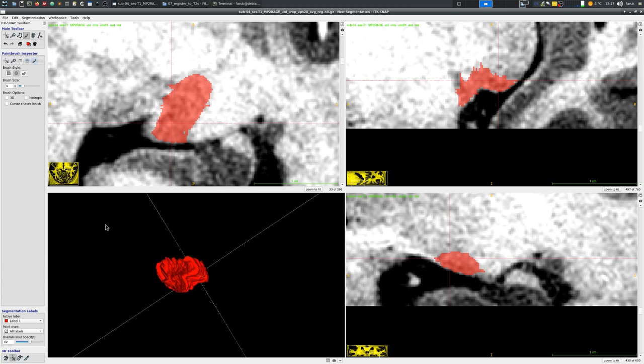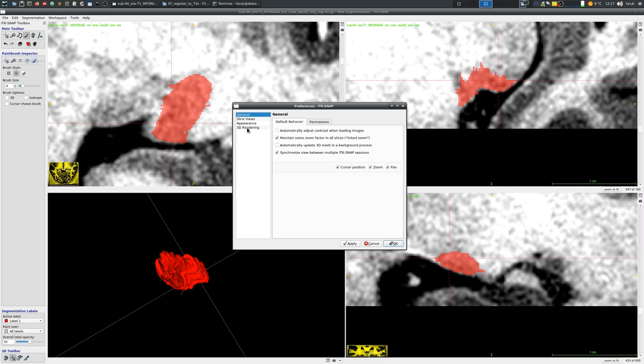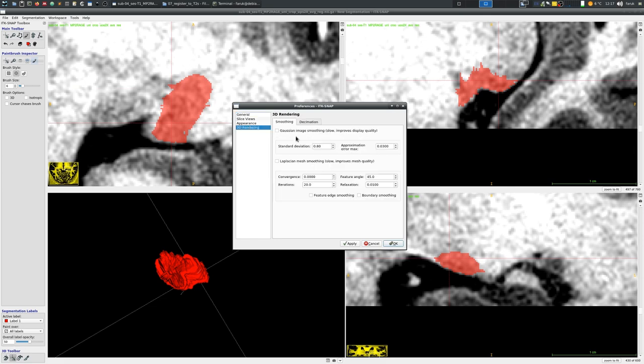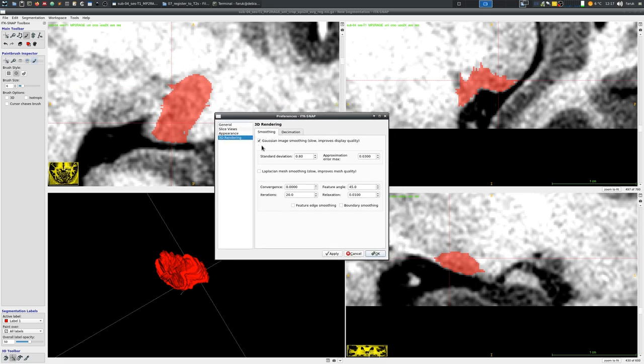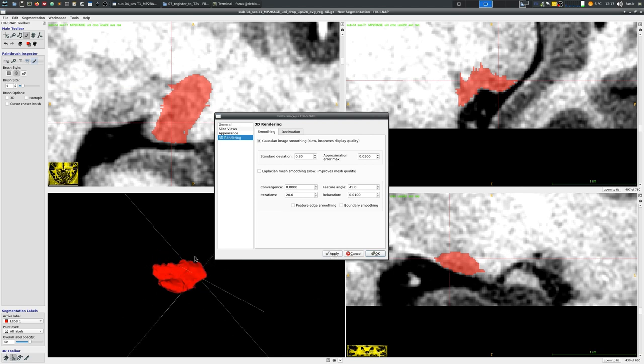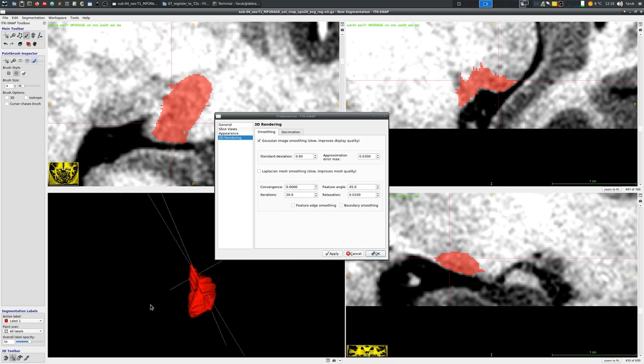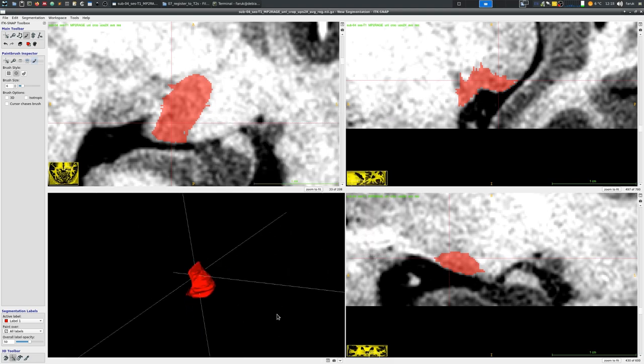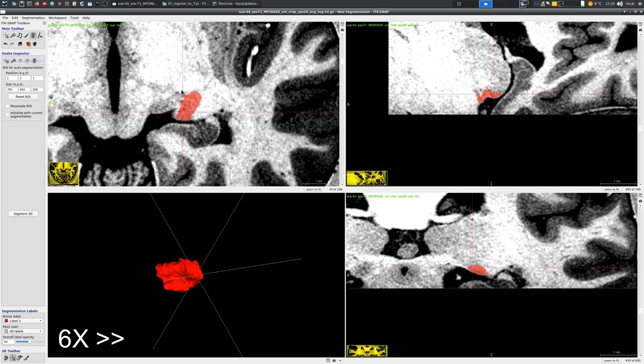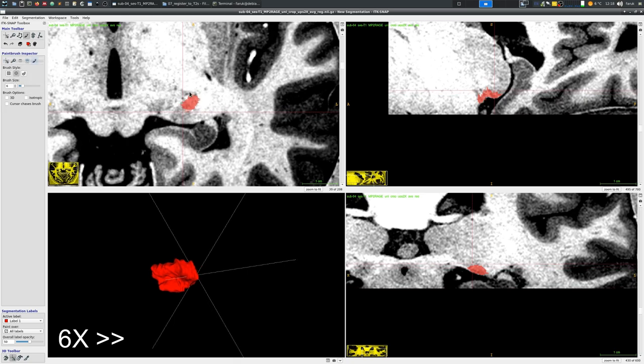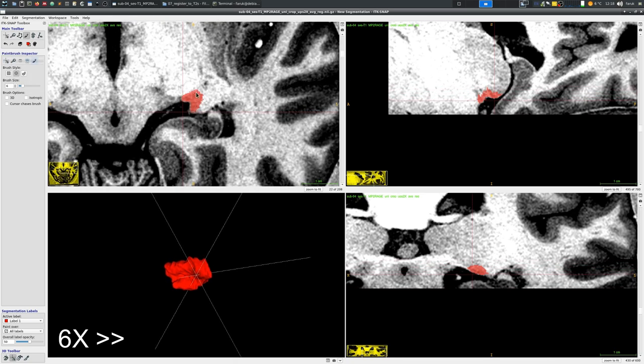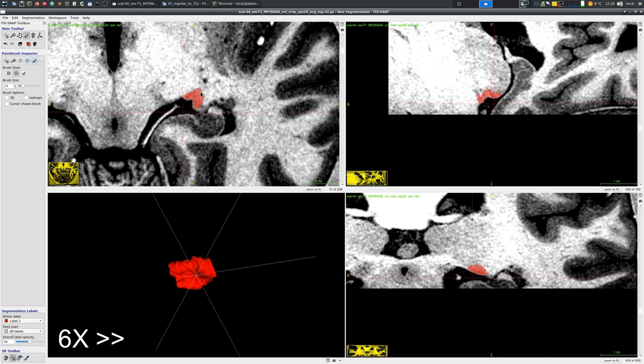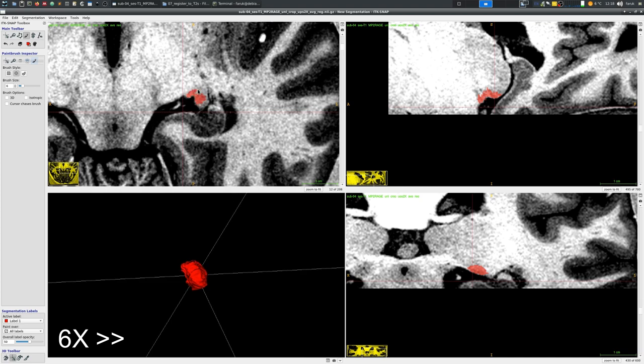One handy option to be aware of is the smoothing of the 3D rendering menu. Here you can see that it was disabled by default in my computer but you can enable it and hopefully you can catch the difference. It will basically smooth the 3D structure that you are rendering on the lower left panel and you can increase the smoothing level if you want to see a smoother structure there.